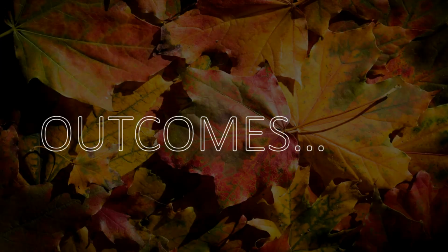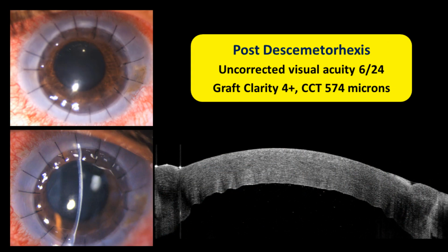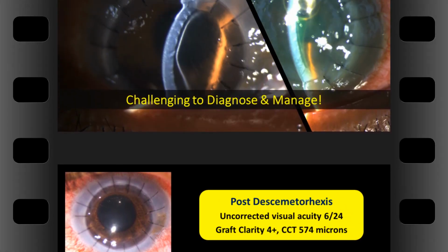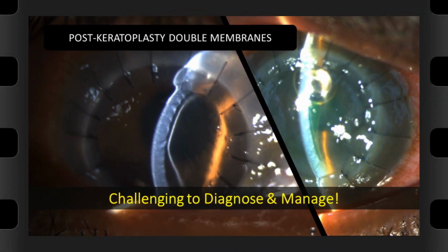On postoperative day 1, the uncorrected visual acuity was 6/24 and a well-apposed graft was seen clinically and on anterior segment optical coherence tomography. To conclude, double membranes after keratoplasty may be challenging to diagnose and manage.